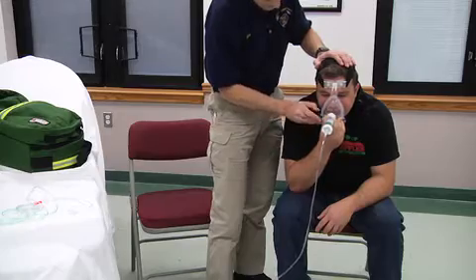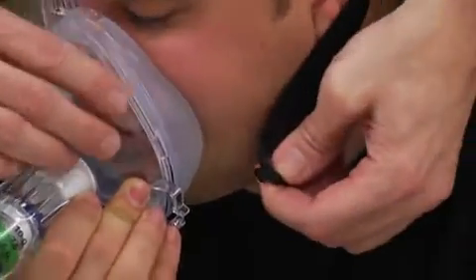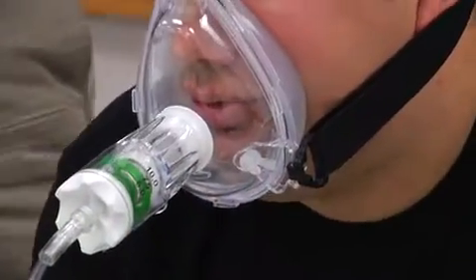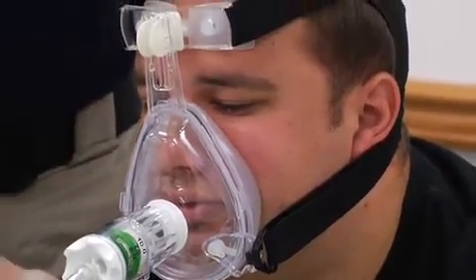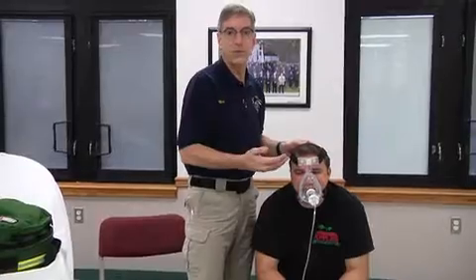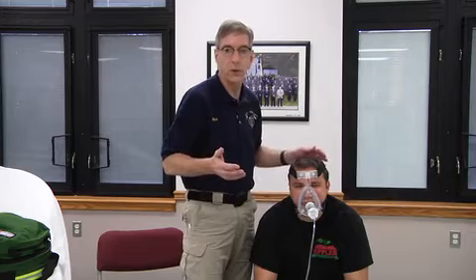Attaching the straps is somewhat tricky — these things come packaged in a very loose fashion. Ultimately you want the mask to hold on the patient so they can breathe adequately and have a seal where you're not feeling gas escaping from around the mask. Note that the mask has a vent where you will feel some gas escaping, because you don't want to asphyxiate the patient should the gas suddenly stop flowing.